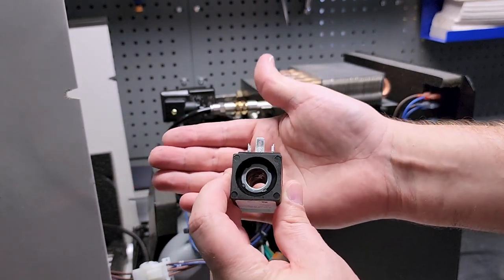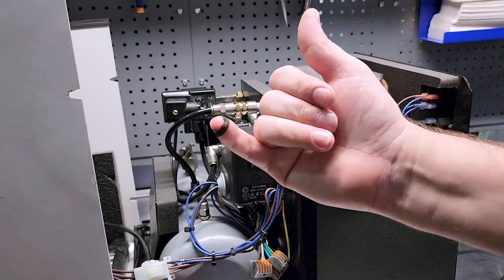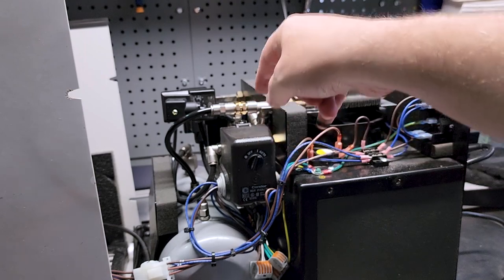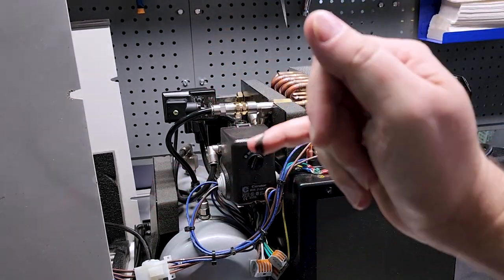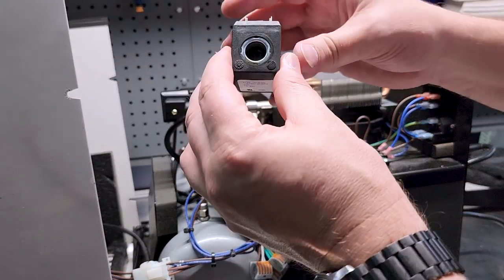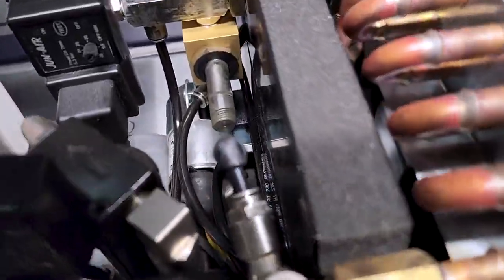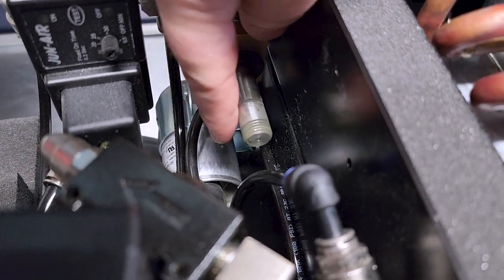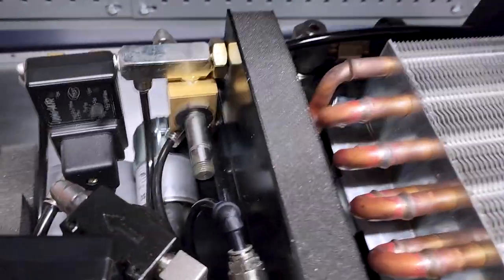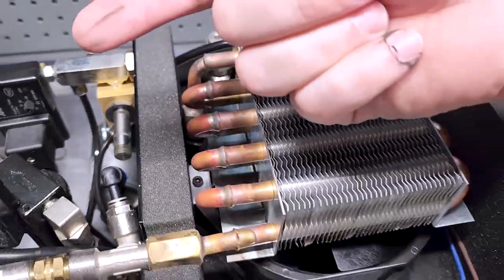So I don't know if you can see it in there. There is a black soot. Let's see. Oh yeah, there we go. Now, this is a non-moving part, so you should not see any soot or anything normally on the solenoid body or inside the coil. And the reason that this is happening is because it is electrically arcing through the solenoid to the system. And I've already wiped some of it off, but right here is where it's arcing, and you can see some evidence of arcing sparks to the valve body, which is crazy. It is absolutely crazy. I've never seen that in my career, that it's arcing like that.